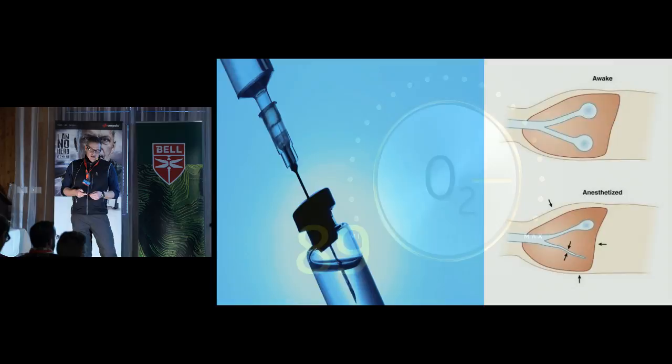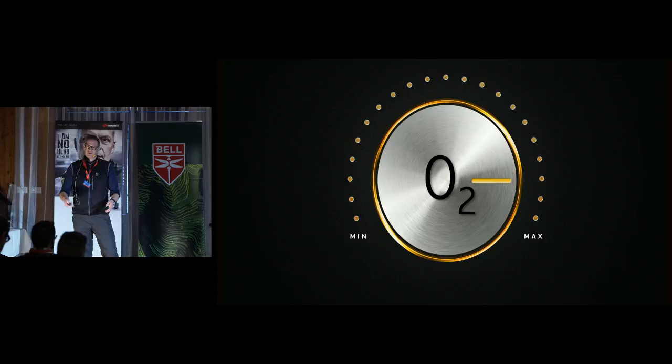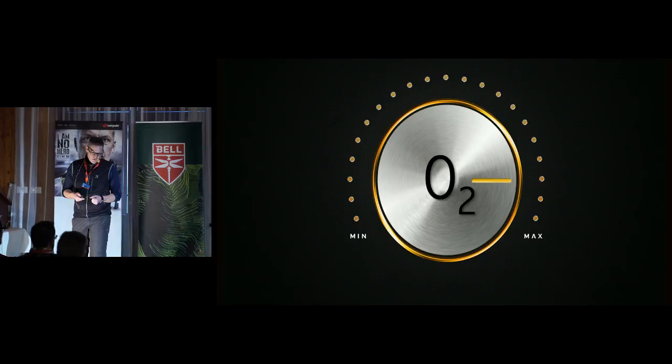And as I told you, the hallmark is that we can dial up O2 as much as we want. This will not have any effect on the saturation at all. What we need is to apply PEEP.